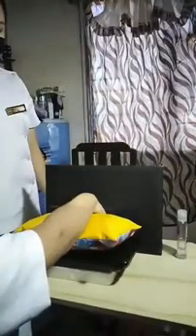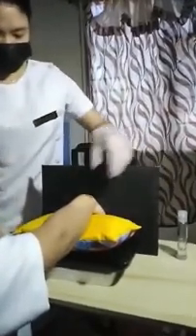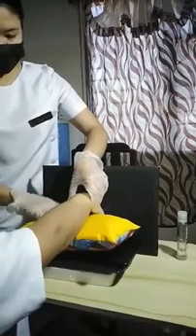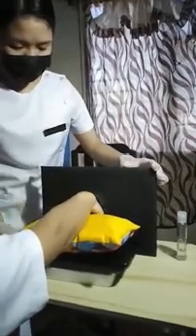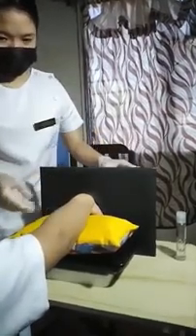Next we have the Lentino method in a tangential carpal bridge, modified method. The patient position, it should be seated or standing. Elevate forearm with sandbag. We use pillows. Wrist flexed at right angle to the forearm. The IR in a vertical position against dorsal surface of the hand, and of course the shielding. The central ray, 45-degree caudal angle, entering 1.5 inches proximal to wrist joint.